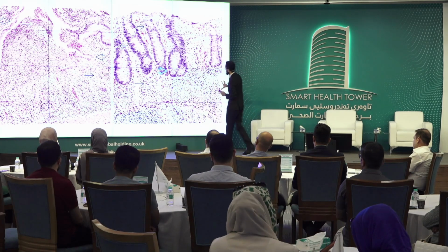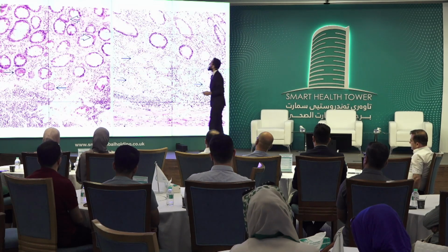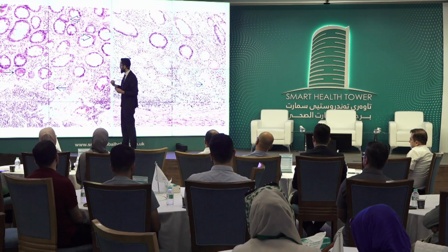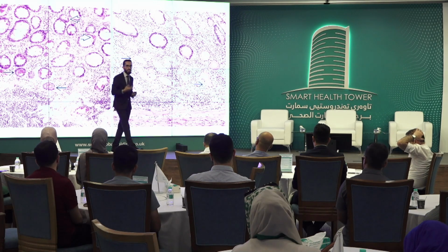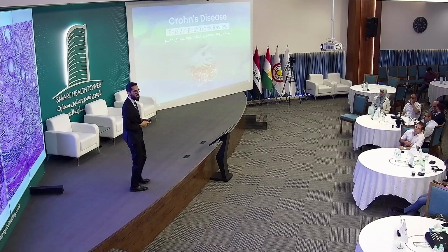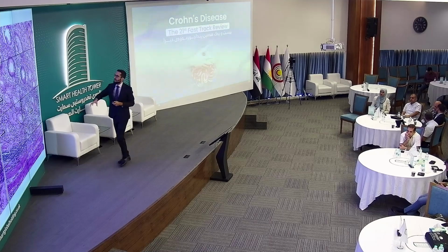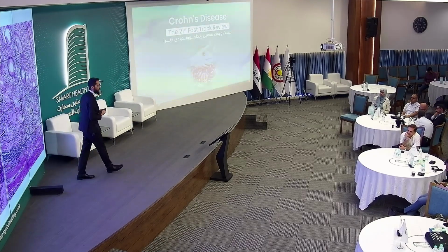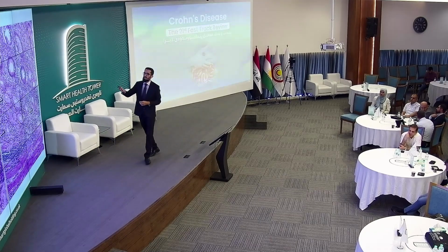Other features, there will be heavy basal lymphoplasmacytosis. We get crypt abscesses, which are collections of neutrophils. Now, Paneth cells, these are normal structures within the terminal ileum, but one of the features of chronic disease is hyperplasia of these eosinophilic cells within the crypts. These produce antimicrobial peptides, and that's why they undergo hyperplasia. Or when you see them in the left colon, they are a sign of metaplasia. These mucinous glands that can develop in the ileum, these are known as pyloric type glands, which are similar to those in the stomach. This is also a sign of adaptive metaplastic change that participates in repair.